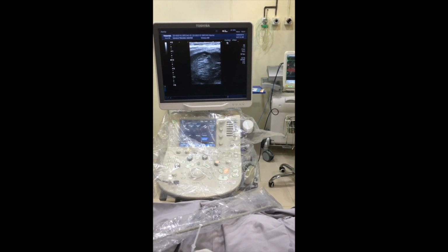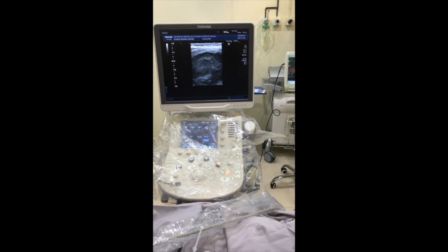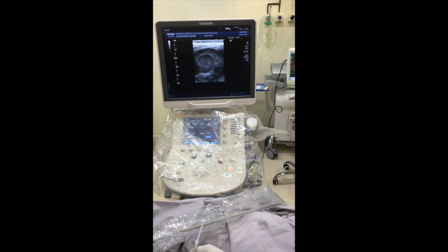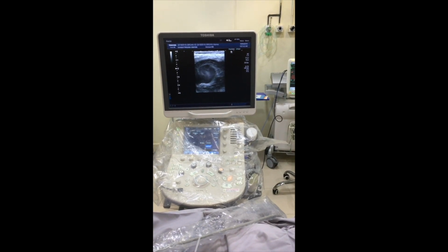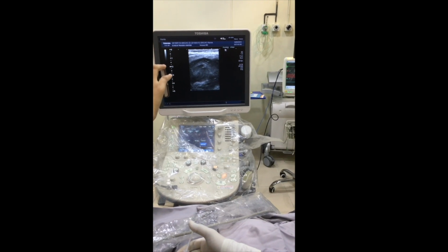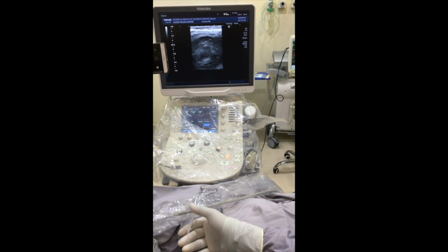Release. You see? When I am in, after that you compress. Compress. Yes. Now I'm injecting. Keep compressing.